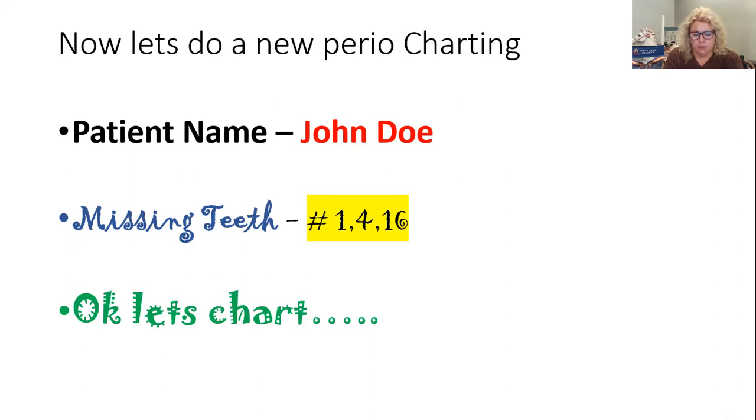3, 2, 3, 3, 2, 3, 3. Where am I? You should have said middle or mid buccal 27. 2, 2, 2, 1, 2, 2, 1, 2, 2, 1, 2.